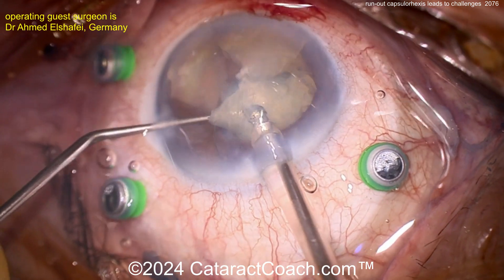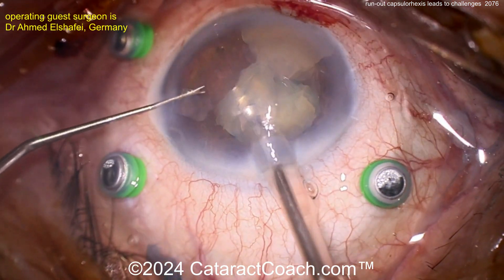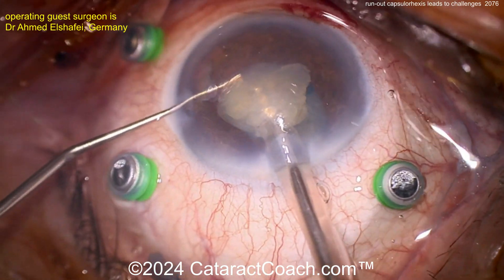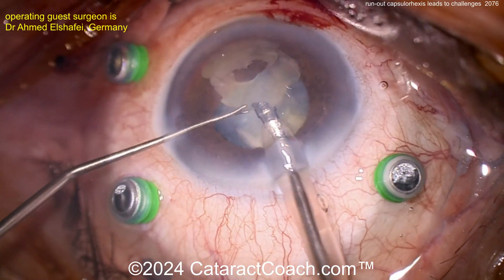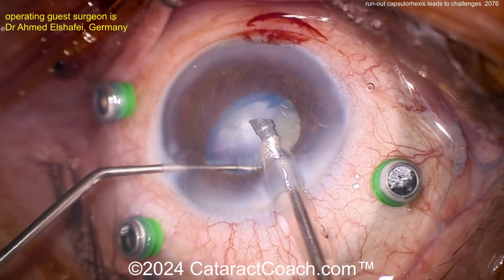Those pieces are coming down pretty reasonably. Probably don't want to chop it up into too many more pieces, because you don't want a ton of pieces floating around inside the eye. I like the technique of about three or four pieces — that should be plenty. These can be aspirated; again, comes down pretty easily.